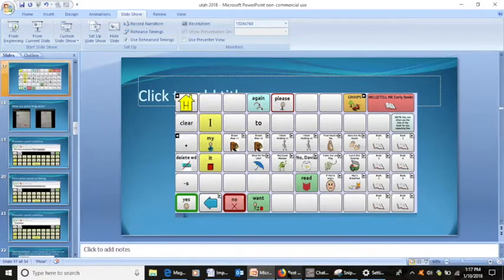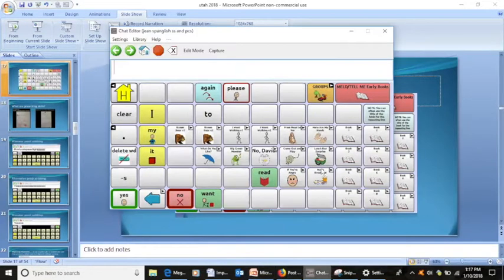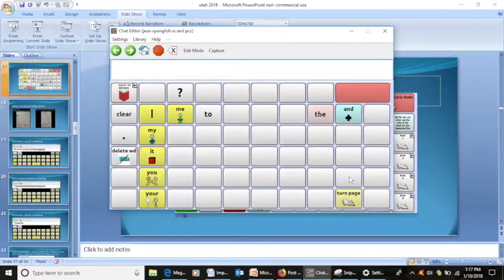Yeah, and the templates, I guess I want to show you that. The templates still have some core language on them, because if you have older kids, but you're working on early literacy skills and you're reading the same book, you know, 4 and 5 times, you can make a page that has the concepts of that book on there.